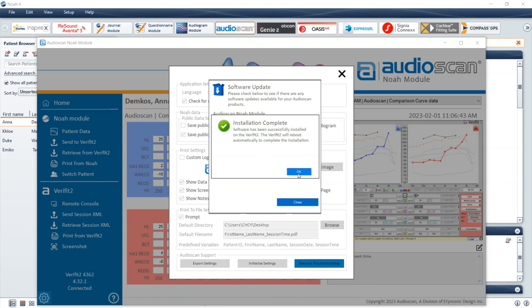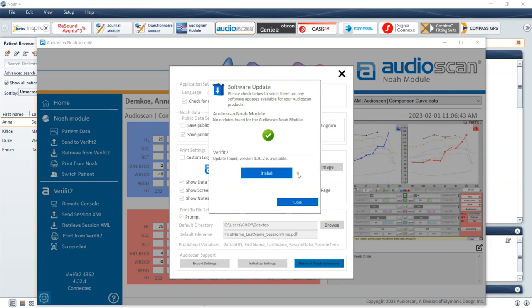Once the software update is finished, a message will notify you of the successful completion, and the VeriFit2 or Axiom will restart automatically. Once the VeriFit2 or Axiom reboots, the software will load with the most recent software version installed.